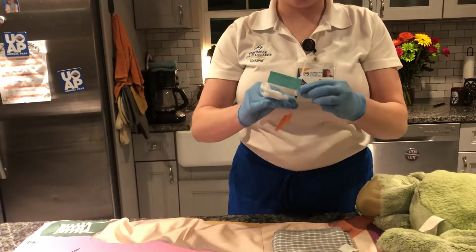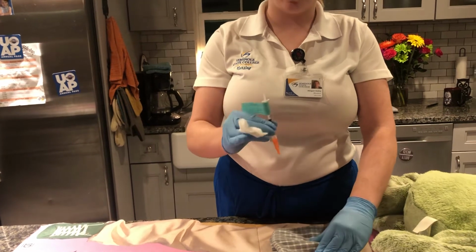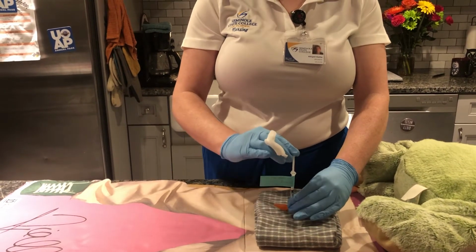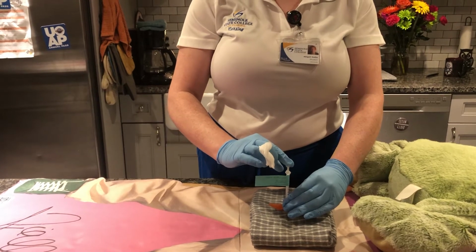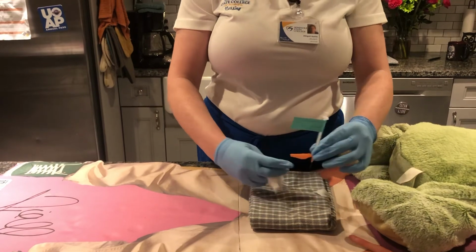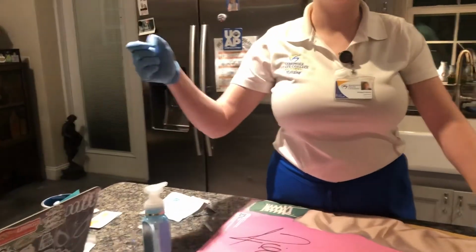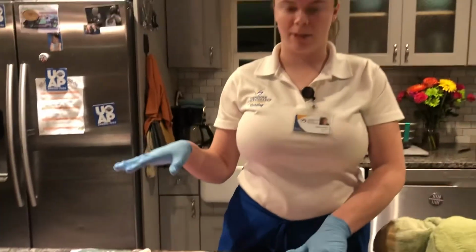I'm going to hold it like a dart in our hand. I can squeeze up to 2 inches, so we're going to go at 90 degrees. So we're going to insert, and then I would steady it, and I would slowly push in the 0.5 without touching that plunger. I don't want to contaminate it. We're going to pull it out, and I would place some light pressure onto here. We're not going to rub it though. And I dispose of this in my sharps container, engaging the safety first. But I'm not going to do that since I'm a student.